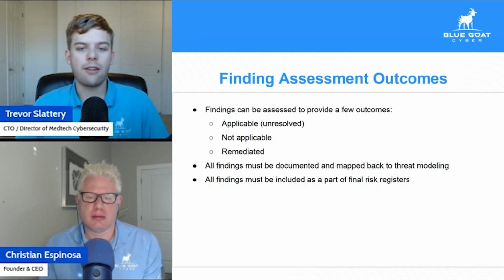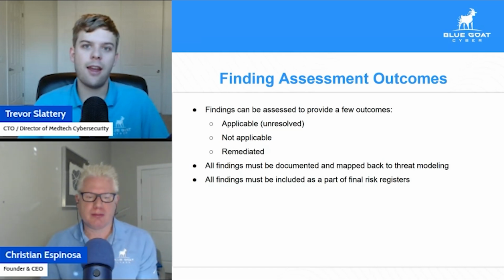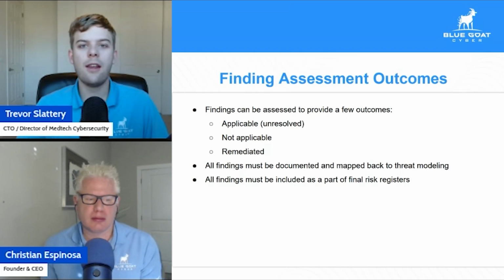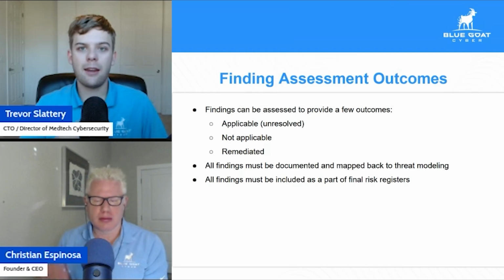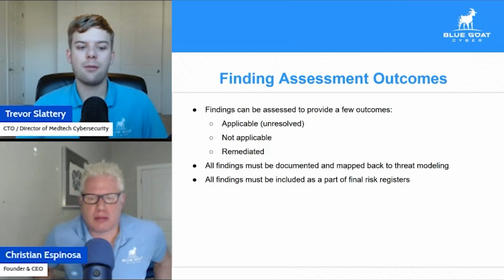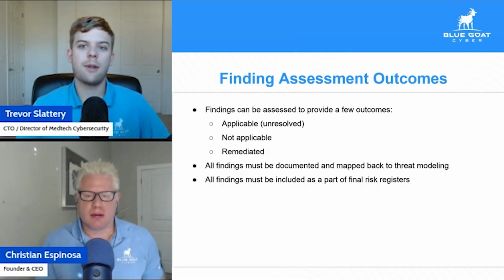So with this getting logged as an unresolved anomaly in continuous review, it can get pushed out and escalated from something acceptable to unacceptable, and that lets you prioritize remediating it. So, continuous monitoring of anything that is not fixed is critical when looking at a risk assessment.